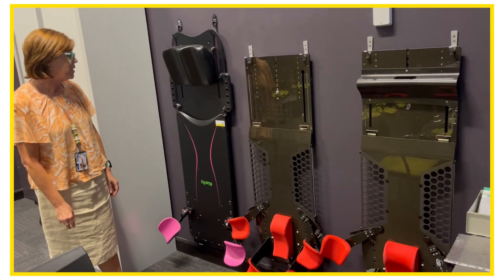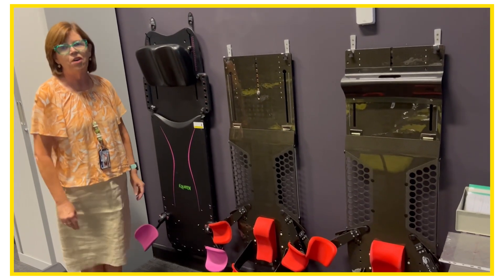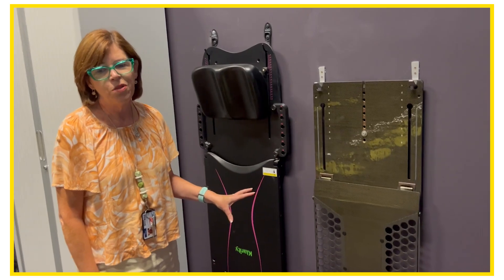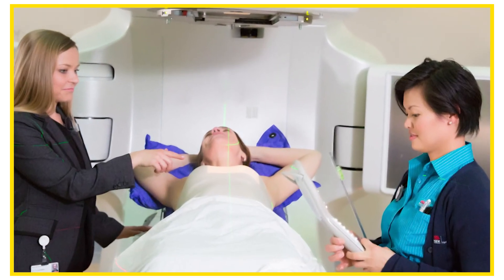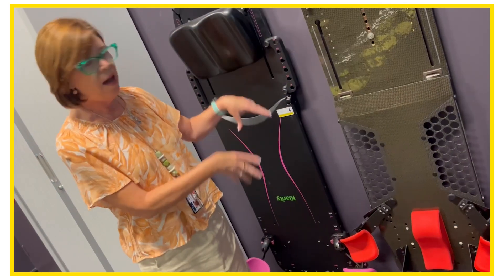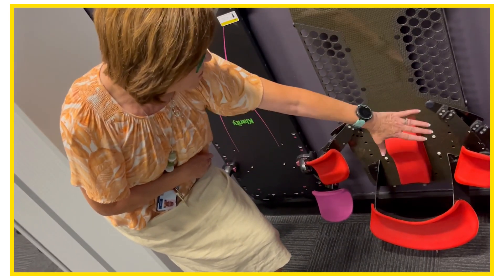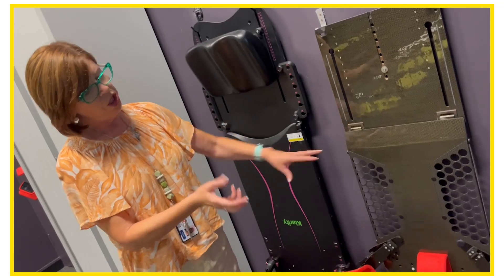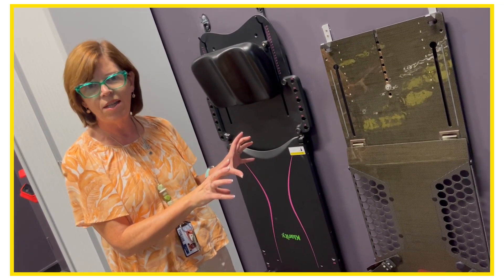These are immobilisation aids or fixation devices. These particular ones are used when treating predominantly breast patients. They have supports — the patient's neck goes here, and these are the arm and hand supports. We're able to adjust it and record exactly how we've set up the patient on a daily basis.